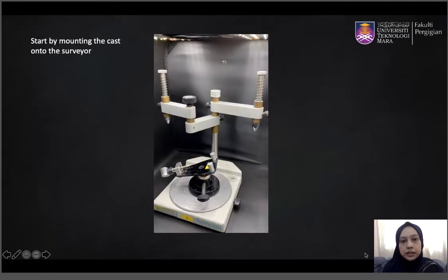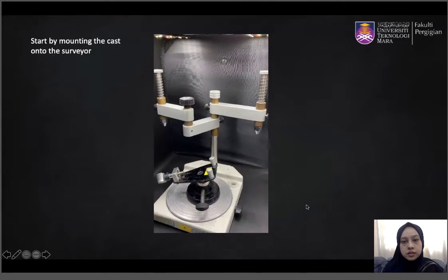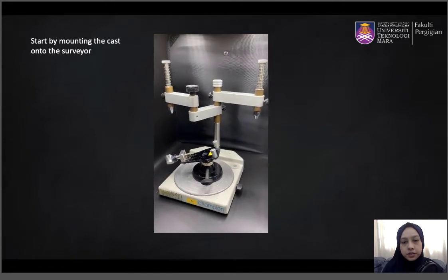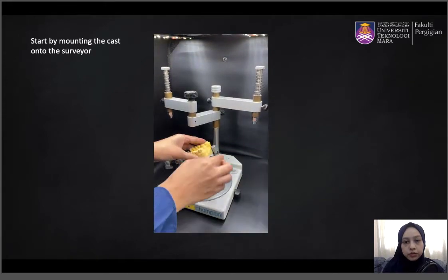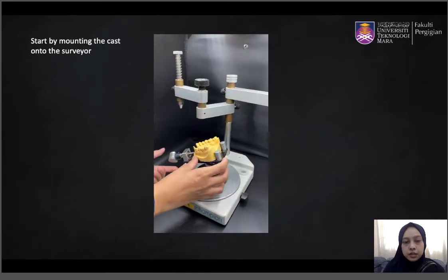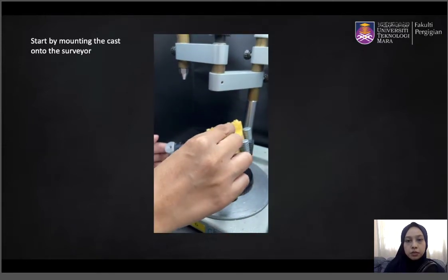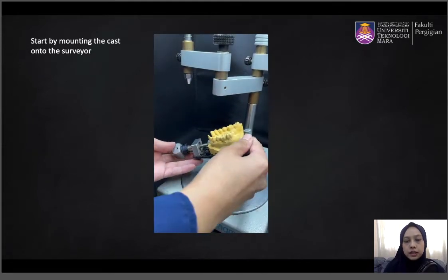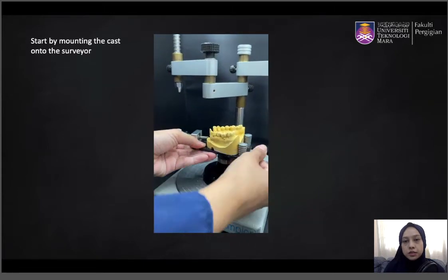You start by mounting the cast onto a surveyor. This is the dental surveyor. Put your cast on the surveyor table and secure it — make sure it doesn't move. Then change the tilt for it to be zero tilt.